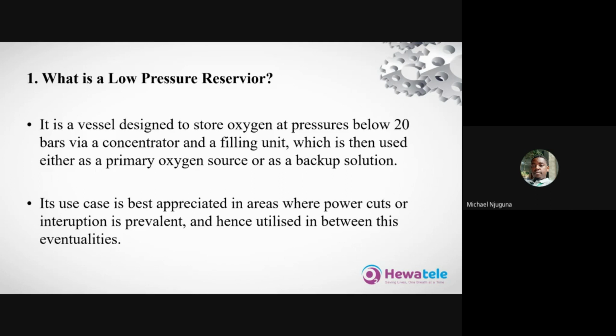So the whole idea of a low pressure reservoir is to mitigate lack of oxygen in between adverse situations. Probably the concentrator is not working, or probably there is no power to run the concentrator. So it is in this desire to mitigate that this invention came about.